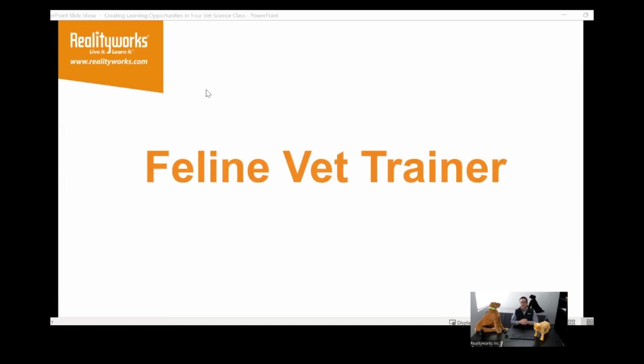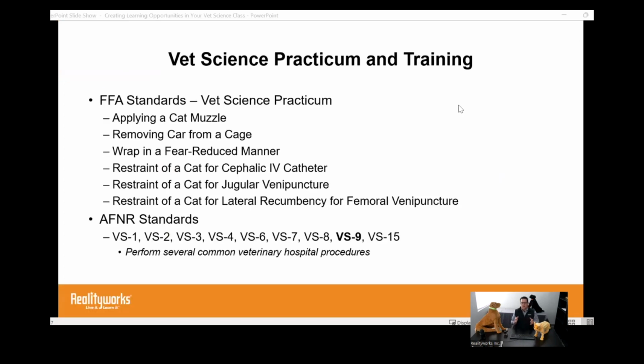We will start with our feline vet trainer today and talk about some of the features, but also how it can be used in your classroom. So I'm excited to walk through what is involved with the feline vet trainer today. To talk through this first, I want to work with our newest model and some of the vet science practicum and training standards that are involved with this.